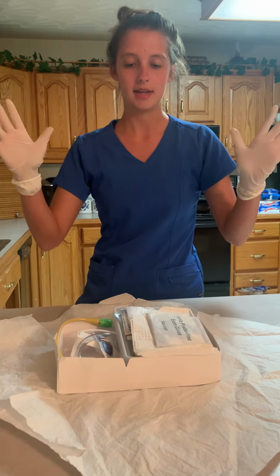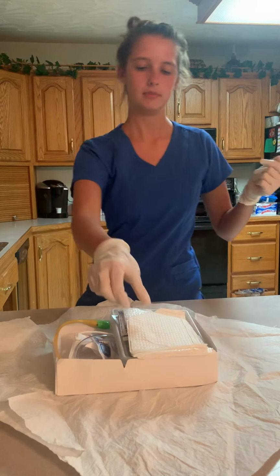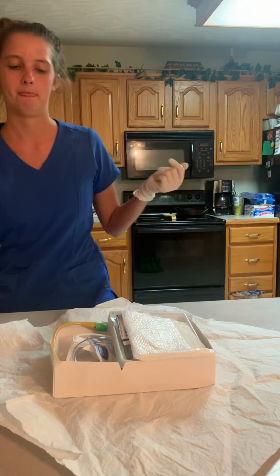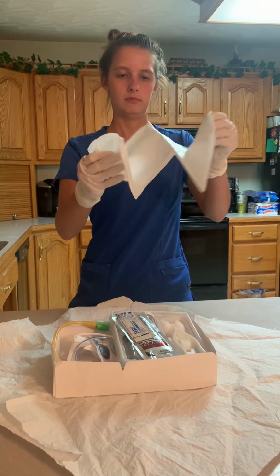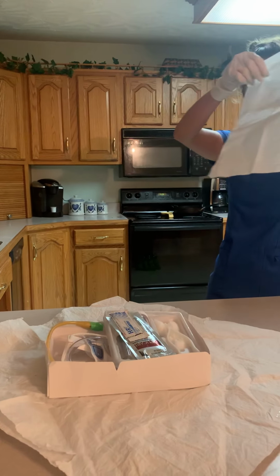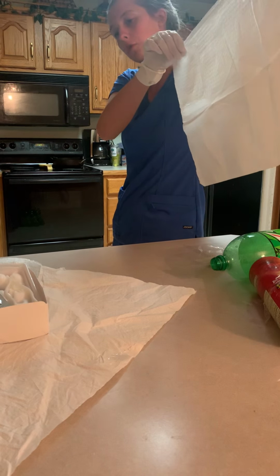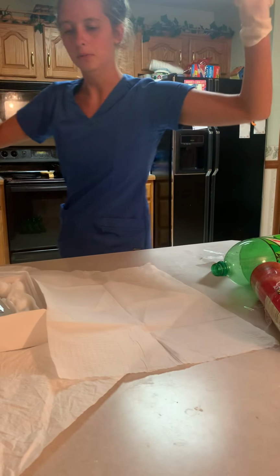And so now I'm just going to go ahead and get anything that I don't need out from the sterile field. So I don't need these gloves, so I'm going to go out and away. I don't need this, so I'm going to go out and away. And now I'm going to go ahead and get my drape ready. And I'm going to put the clear side down, or the shiny side down. And we're going to go here, and we're not going to cross over our sterile field. We're going to go out, and then we're going to let go.